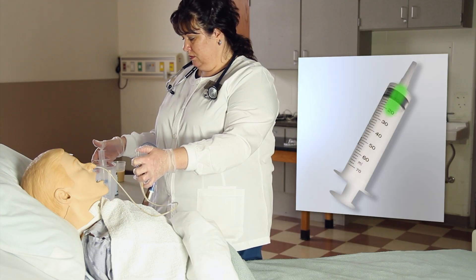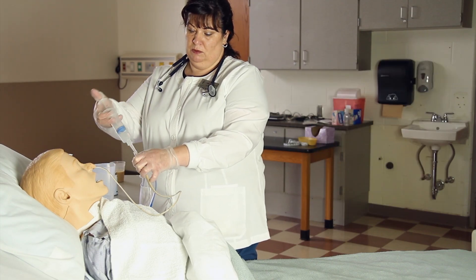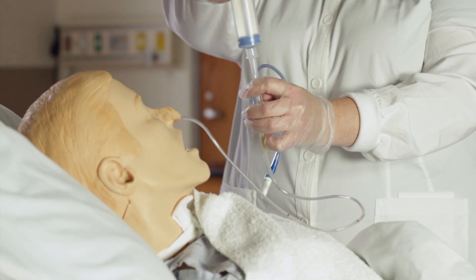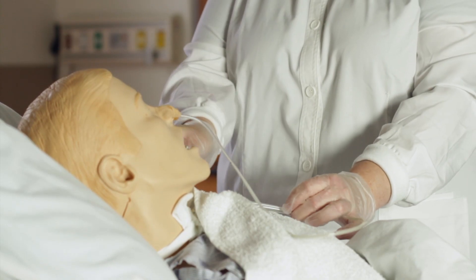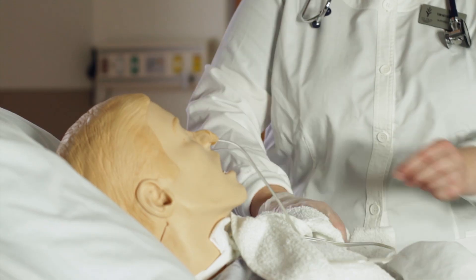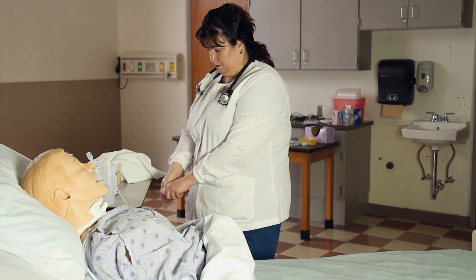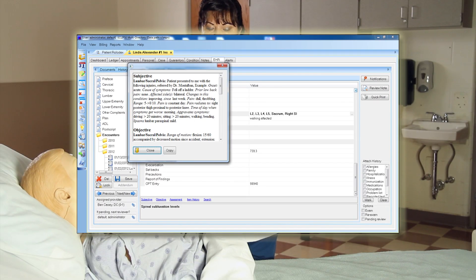Replace bulb and draw up 30 milliliters of irrigation fluid and flush the tube. Clamp or plug tubing. Assist patient to a position of comfort. Put equipment back appropriately. Remove gloves. Perform hand hygiene. Document in patient's chart.